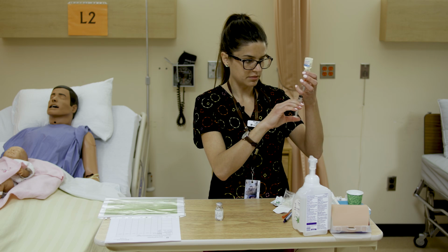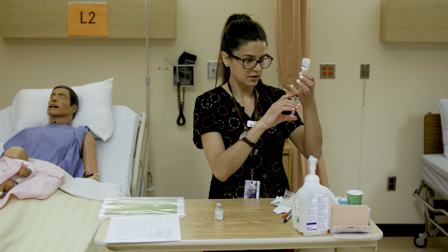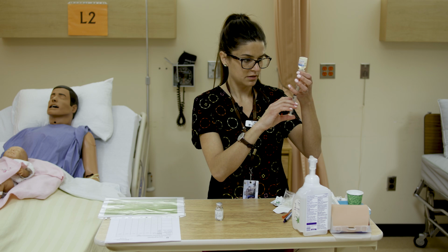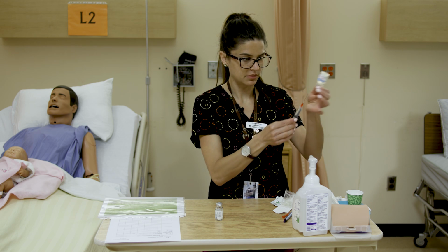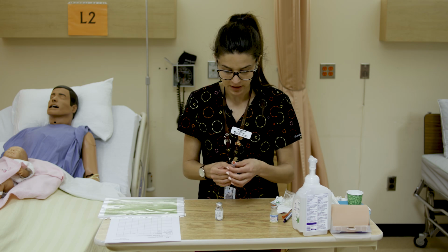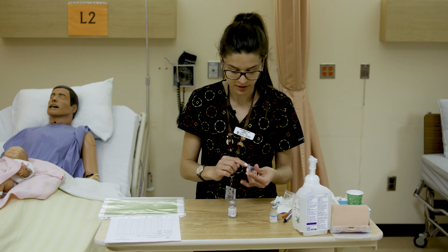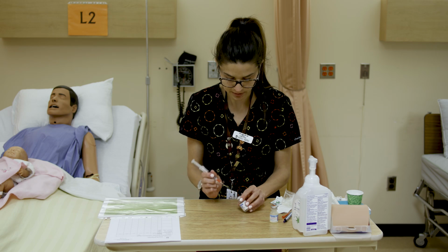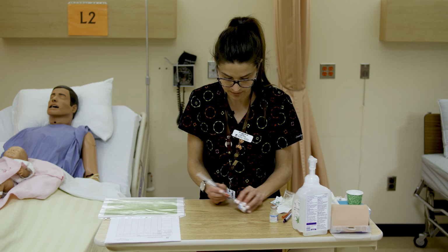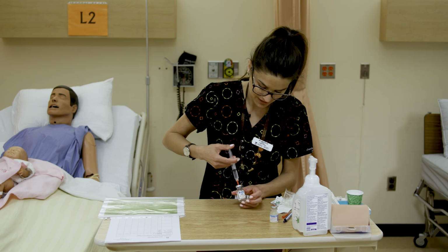And so we're just going to recalibrate to our 3.5. There we go. And we're going to take it out of our sterile water. And we know that this one is clean, so we're going to inject all of our 3.5 into our ampicillin powder vial. So we're going to stabilize and inject.